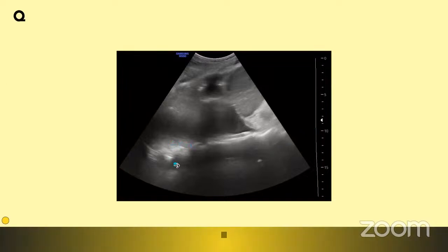Yeah, this is another thing which I like to teach you. This is a much more beautiful one. This is one of the classic signs which you would find. And by the way, this Samsung written here, right? This is the probe orientation marker. So you can first identify the region.